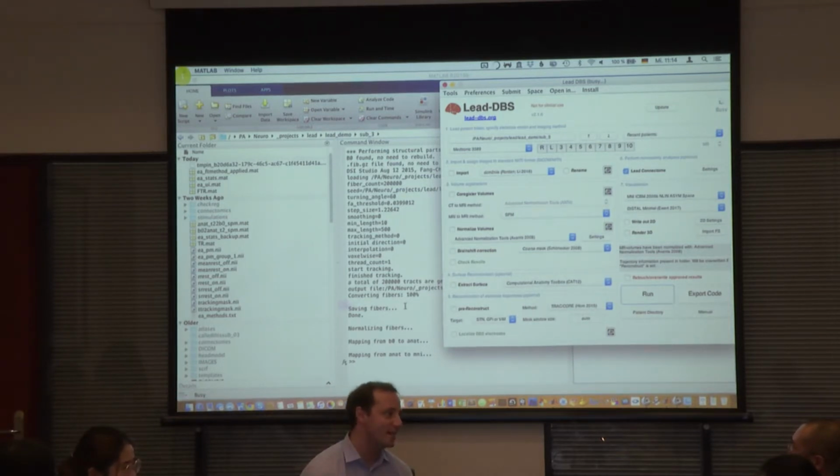I think there are even some experts that say it's not always good to do everything, but I agree, so we want to add these tools as well. I think Ningfei is thinking about putting FSL's eddy and topup into it at some point, but we need to find the time. But if you want to do that, you should run it in FSL and then put in pre-processed data.